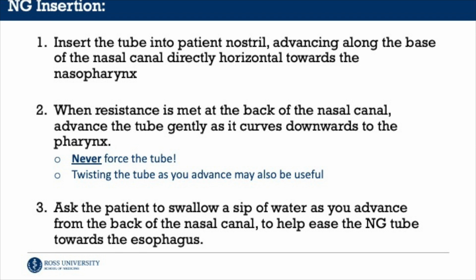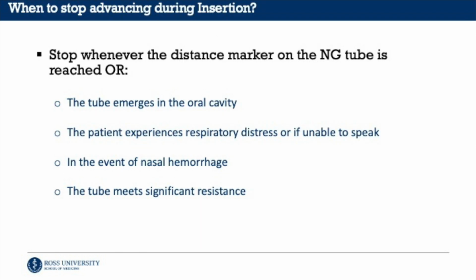Ask the patient to swallow a sip of water as you advance from the back of the nasal canal to help naturally ease the nasogastric tube towards the esophagus. Now you may be asking yourself, well, when do we stop advancing during insertion? Well, let's talk about it.